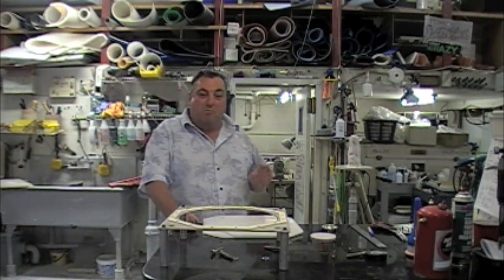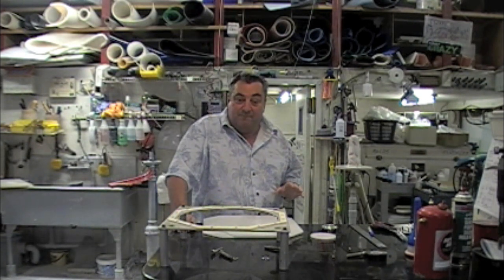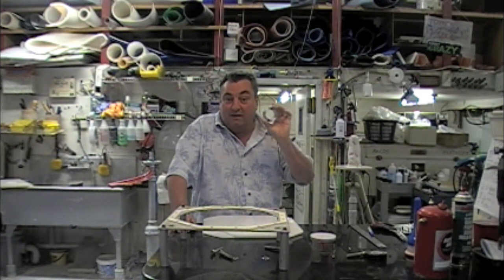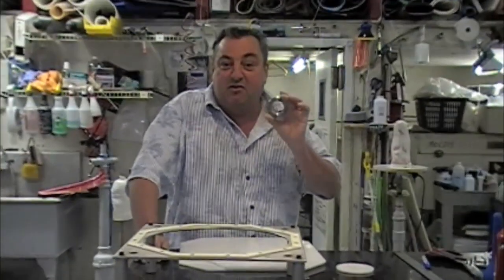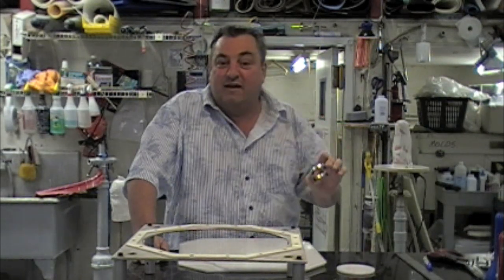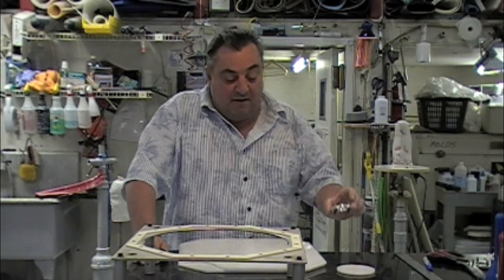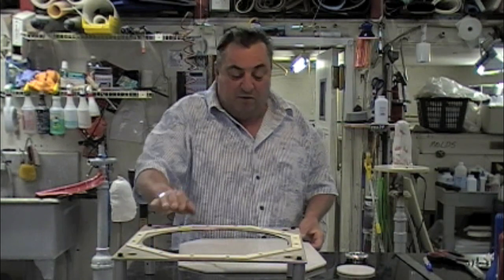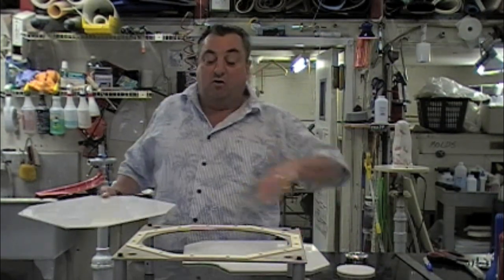Today we're going to make a co-polymer definitive socket with the attachment plate molded right into it in one procedure. This is an unbelievable thing that you can do — save a tremendous amount of time and build a prosthetic socket that's far superior to anything we're used to doing. It's just a matter of layup. We're laying it up upside down because it's going to be flipped over in the oven.